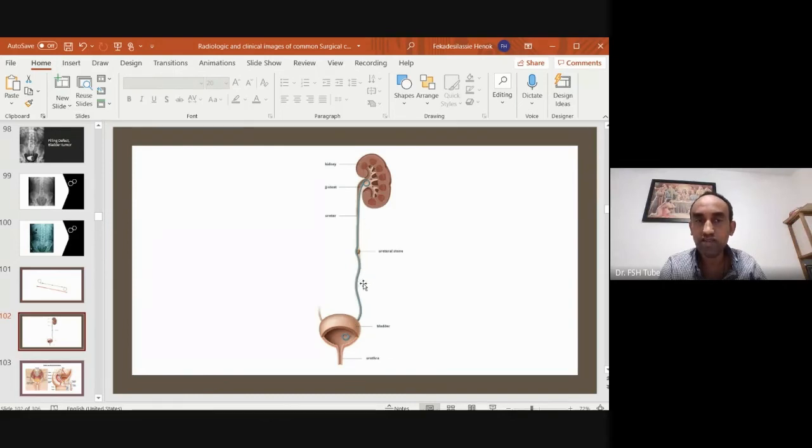It prevents complete obstruction due to the passage of a stone. You see, this stent is allowing the urine to trickle down. So you avoid complete obstruction, okay?